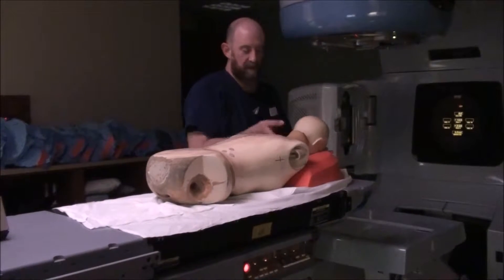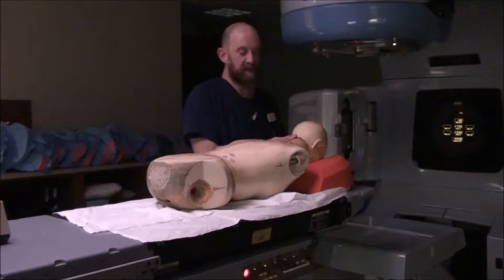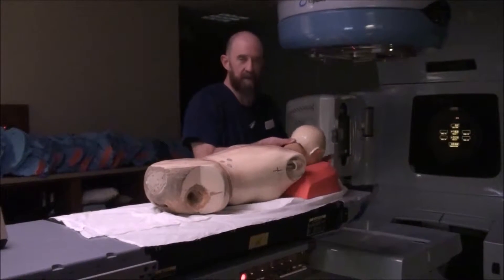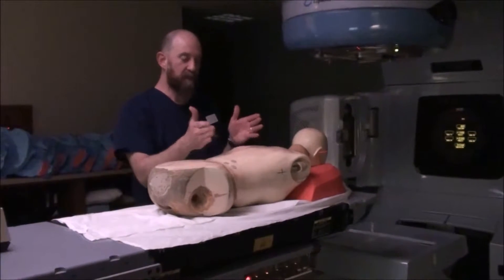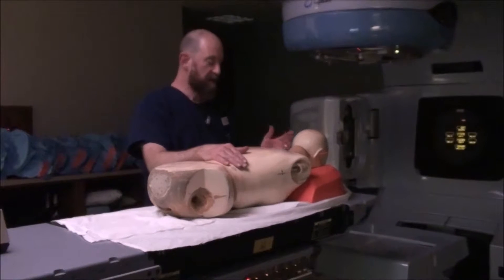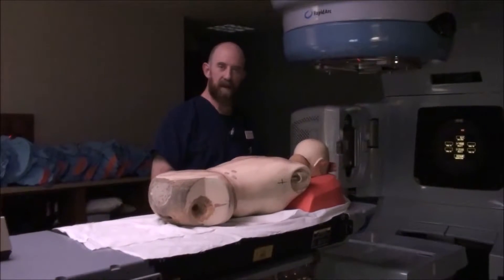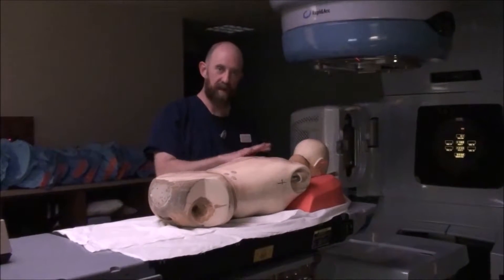Make sure they are on the prone pillow properly. Because if you don't, the position might be different today versus tomorrow versus the next day, and it's going to stretch them in different ways. You want reproducibility — you want them to be in the same place in the same way every time.